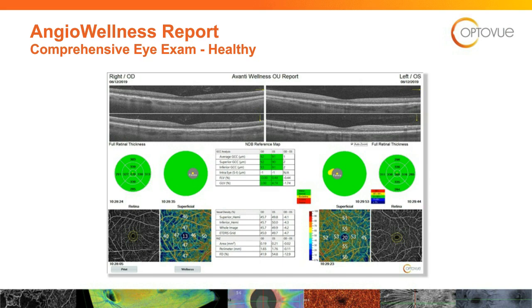Then I go over and point out the other scale here, where green is in the middle because it goes up to these retina scans. The retina can swell, which would be yellow and red, and the retina can have atrophy, which would be blue. And then I quickly go to the outside scans and say, look, everything is in green. So we're good there. We go up and look at the B scans, and I say down here where this white line is, this is where macular degeneration occurs. We're looking at the retina, where diabetes and high blood pressure vascular changes can occur, and then we look at the vitreal interface, where floaters and PVDs, and as we all know, epiretinal membranes would occur.